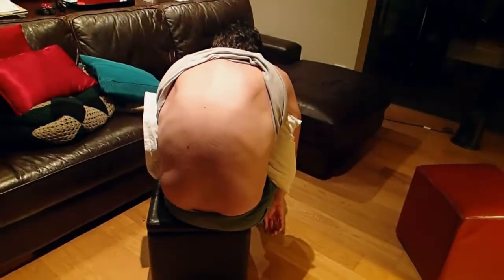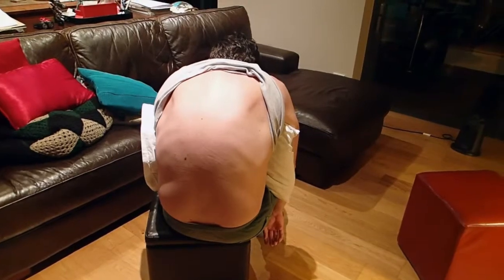And I'm just going to zoom out a little bit and show that the lumbar vertebrae are poking out and are very easy to see in this position. And what I'm going to do is show the surface markings that we're going to be feeling for when we're doing the spinal anaesthetic.